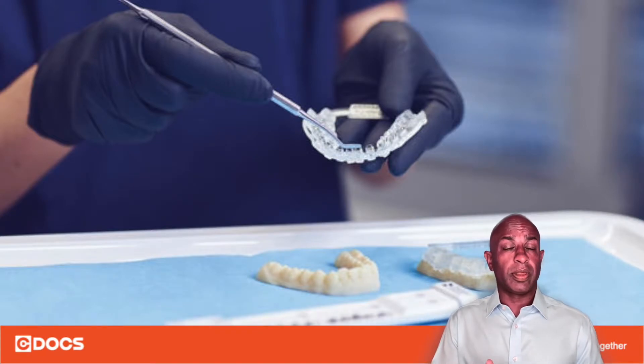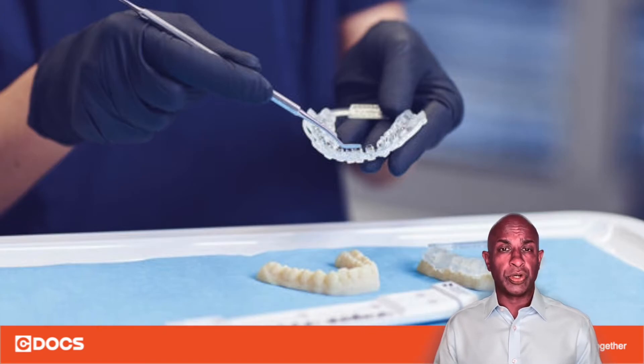It could be a flowable, a medium viscosity, or a high viscosity composite agent. Whatever works with your team and in your hands is completely fine.